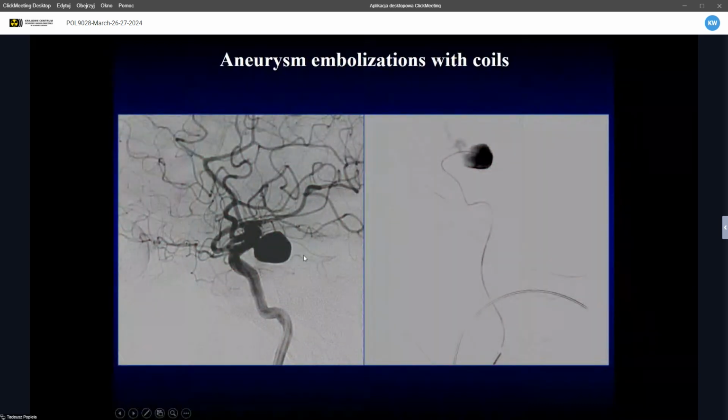On the image on the left, this is the standard image of an aneurysm on the top of the, maybe not the top, but the distal part of the internal carotid artery. You can see the aneurysm sac and the junction point. We call it the neck, as I mentioned. This is quite convenient for us and for the patient because you can see that this neck is quite narrow compared to the biggest diameter of the aneurysm.